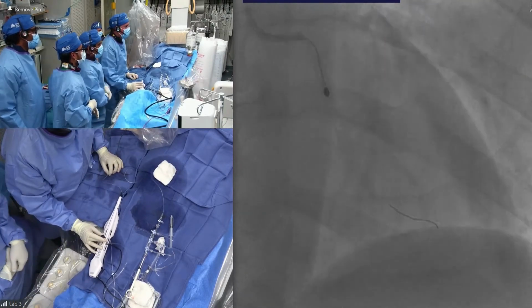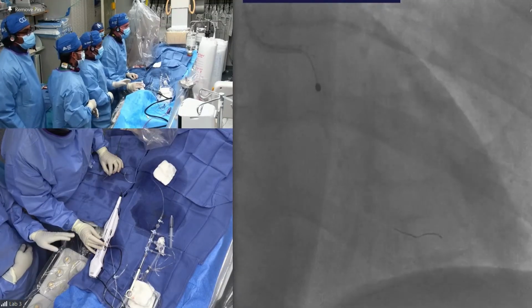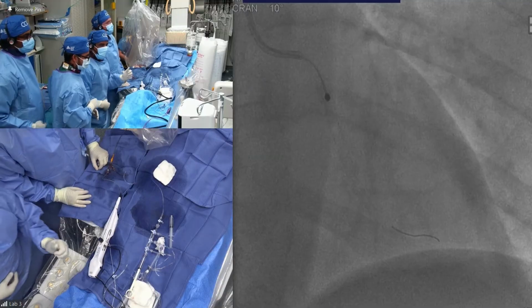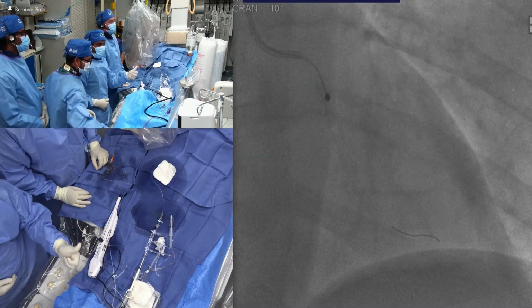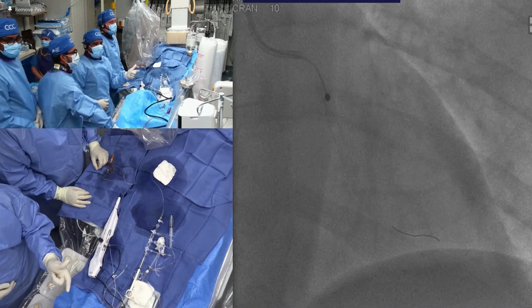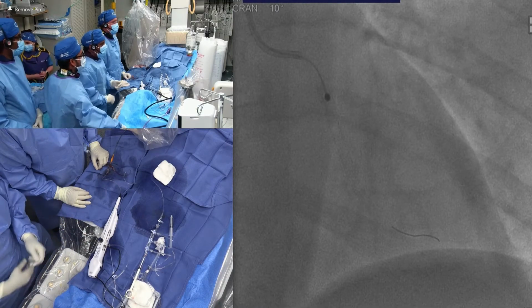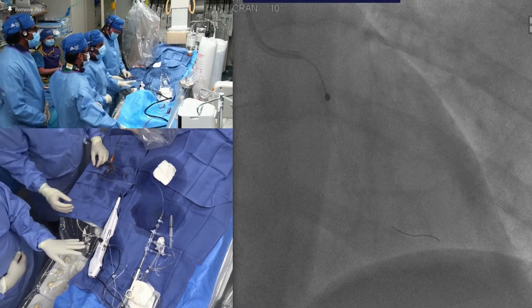And I see you don't have a pacemaker here. Yeah, so the key is very simple. Radial, we try to avoid pacemaker. You give aminophylline 300 milligram and atropine 0.6 to 1 milligram. Pulse rate is good. We start with a 2-0, maybe a little more aggressive.